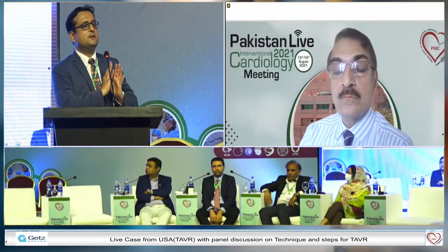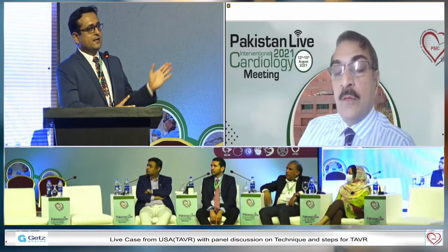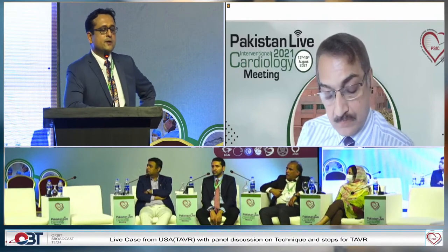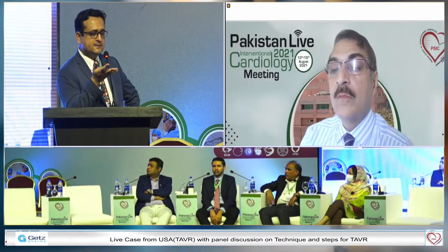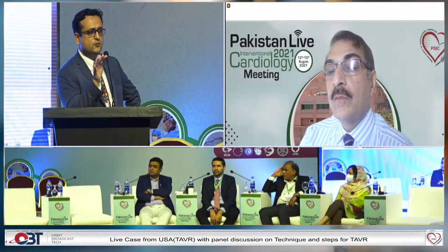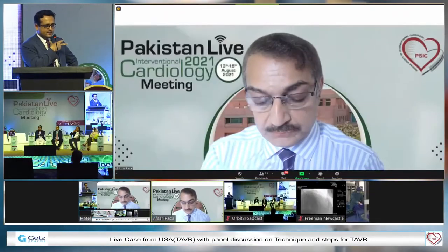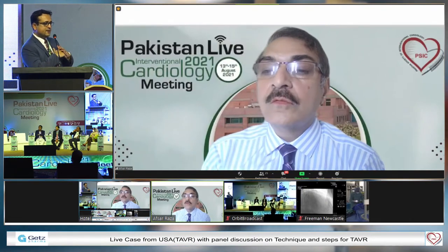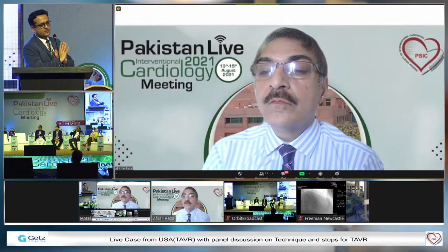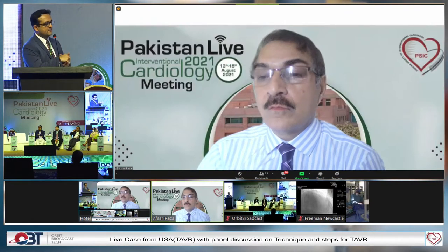So cusp overlap and commissural alignment are two different things. Cusp overlap is what Dr. Tahir Khaili showed, when you're trying to deploy the valve fluoroscopically. Obviously previously we used to use TOE and things like that to align your valve. Now we just go fluoroscopy. When we started doing TAVRs, what we thought, as just how we see it on echo, was that the place where you see the three coronary sinuses is the widest part, and that is what you should think of as the annular plane. That's where the annulus is. That's where the attachment of the leaflets are.